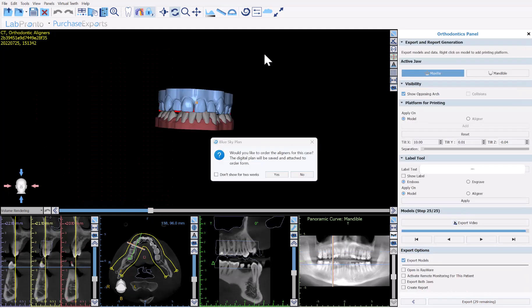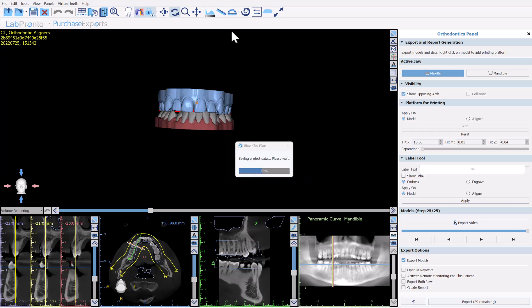What comes up on screen is the option to order the aligners for the digital plan we just created. This option is currently available in the United States and several other countries, and will be expanding to additional countries over time. If you're manufacturing the liners in-house, go ahead and click no and don't show for two weeks.